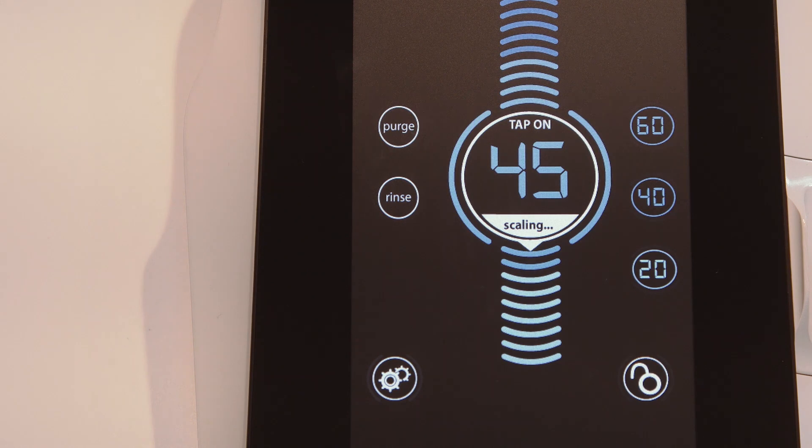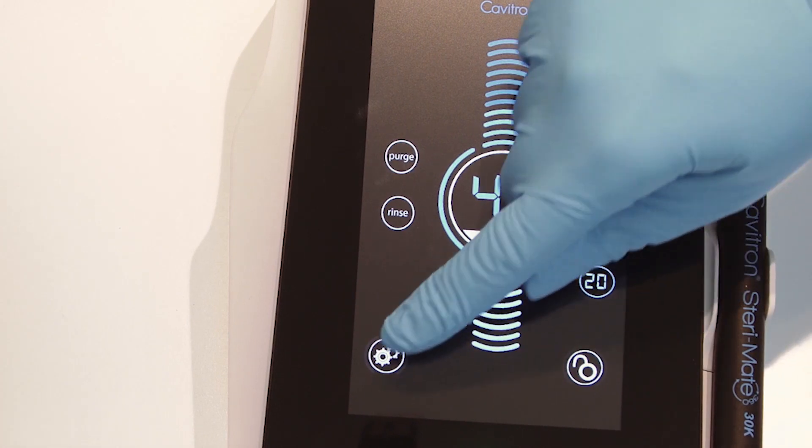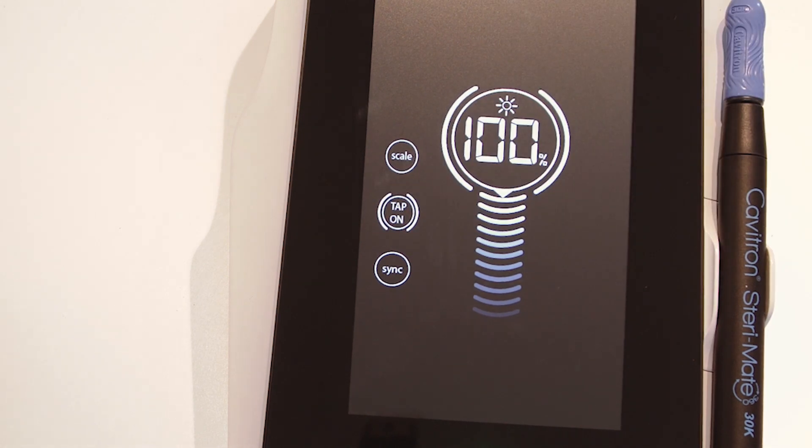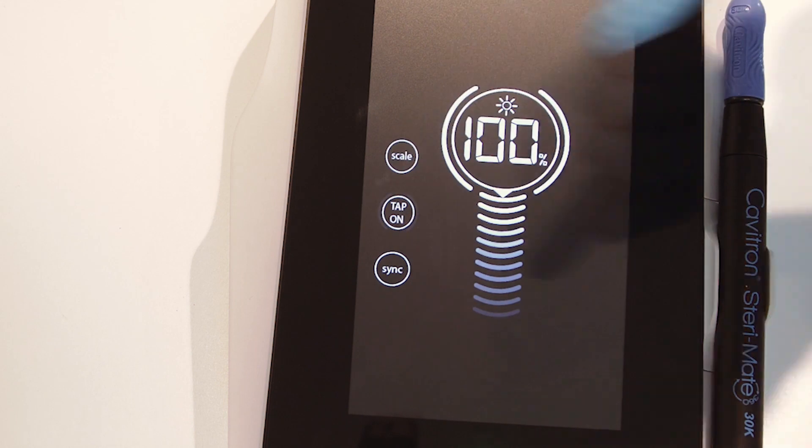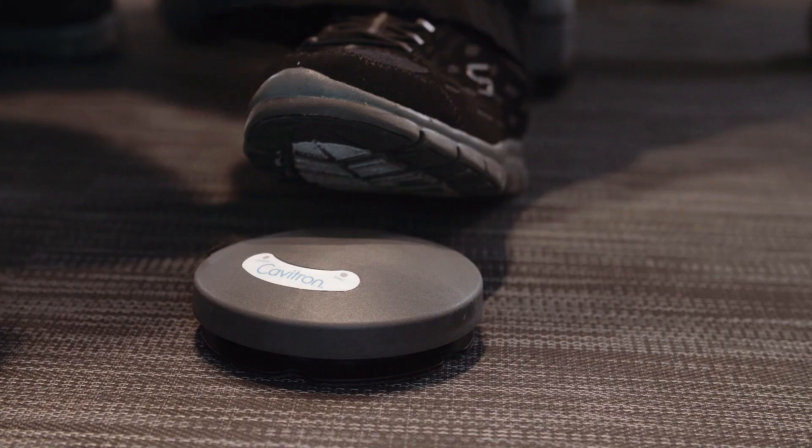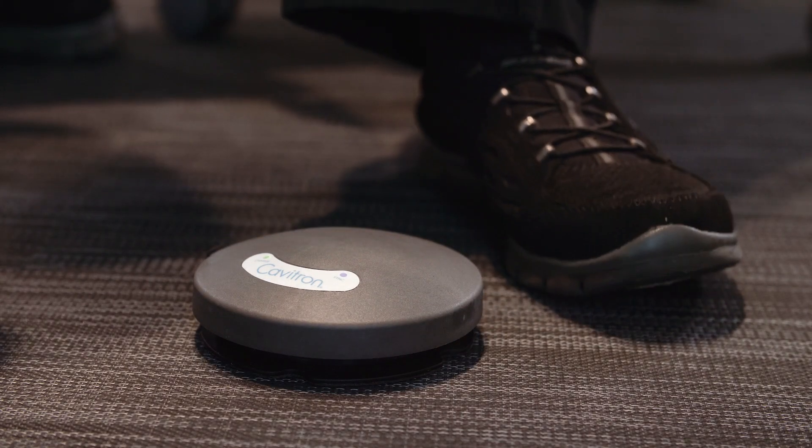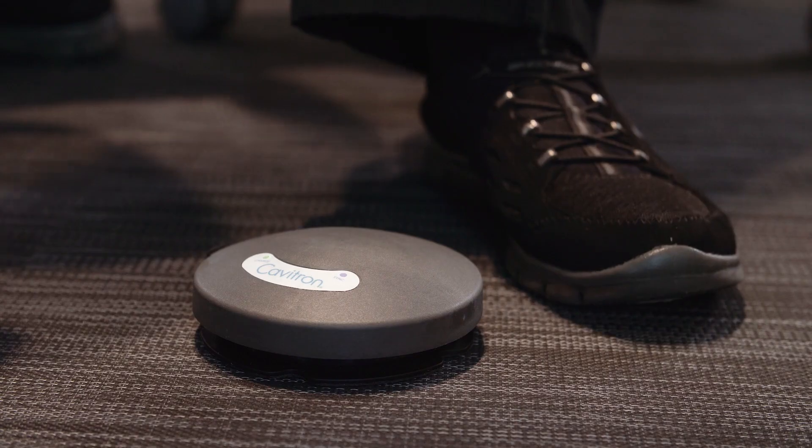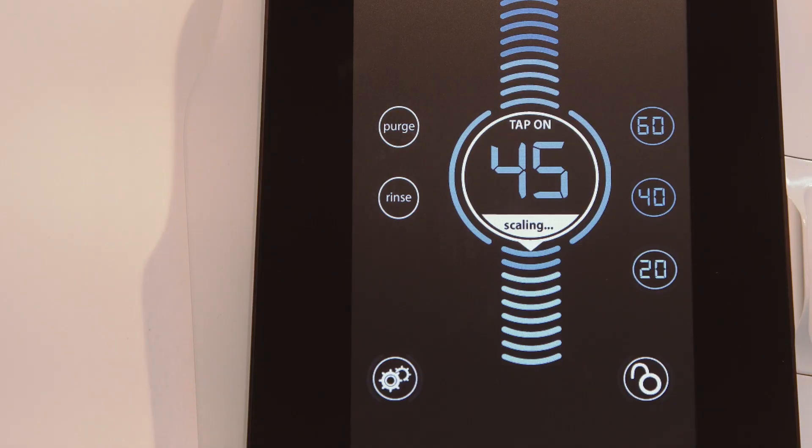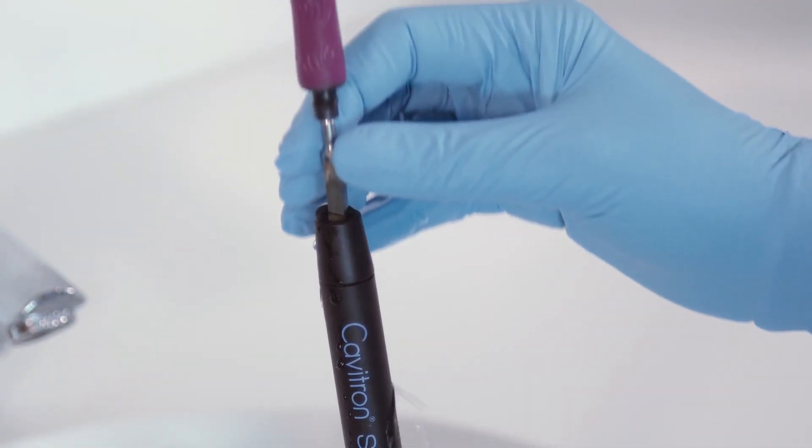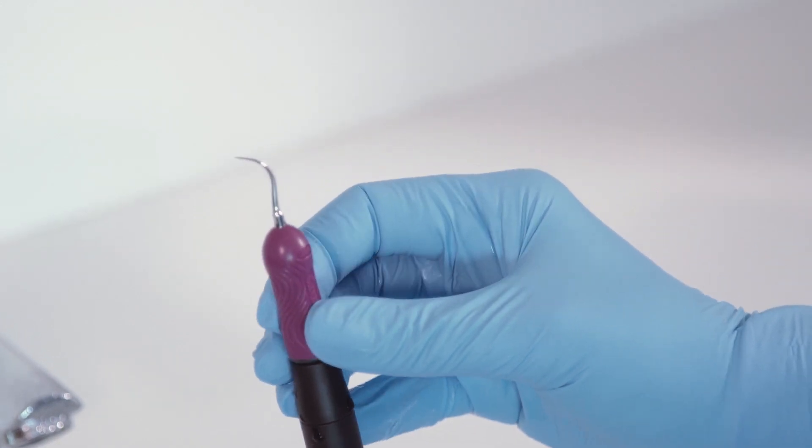This feature eliminates the need to hold down or pump the foot pedal, adding comfort to your routine. Enter the settings screen to enable or disable tap-on. When parentheses are shown around the tap-on icon, tap-on is activated. If there are no parentheses visible, tap-on is deactivated and the icon will be grayed out. With tap-on technology activated, tapping on the foot pedal once will activate ultrasonic power for approximately four minutes. Tapping the foot pedal a second time will disable ultrasonic power and water flow. On the main scaling screen, a tap-on indicator will appear in the power level display while scaling. Please note that tap-on technology only operates when an insert is seated in the handpiece.